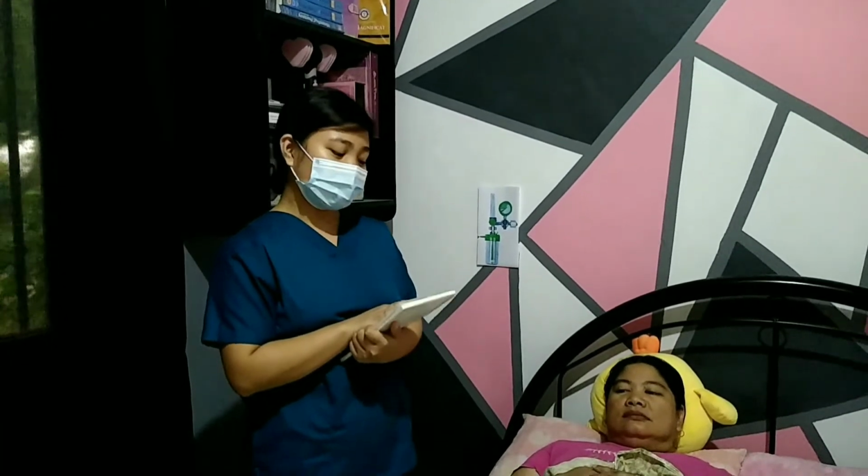After coughing, note the patient's most recent ABG results or SpO2 value. And then lastly, don't forget to review the patient's medical record for the order of oxygen. For the planning, you need to identify the expected outcomes for your patient. And for this procedure, we will be doing the administration of oxygen.